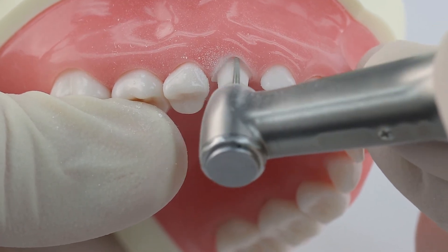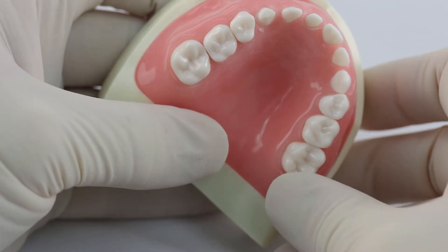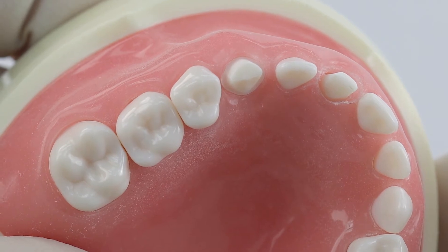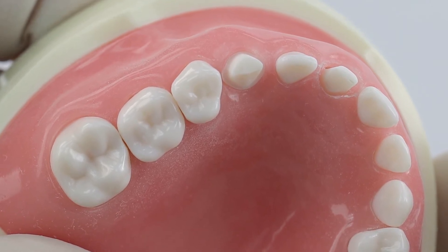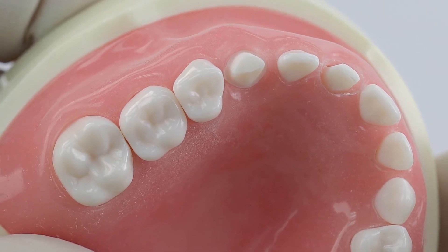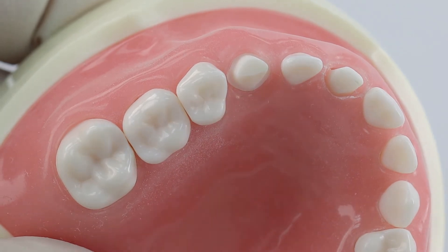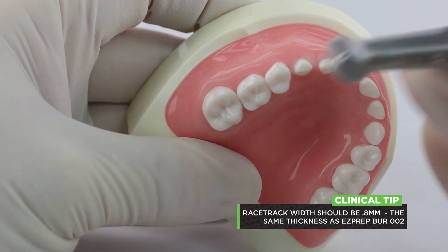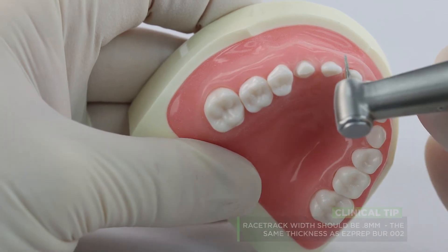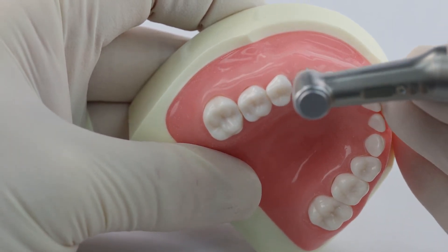That is our completed racetrack of our cuspid preparation. You can see that's a nice, good-looking racetrack — it's easily visible right away. Now the differences: the similarities between incisors and cuspids are that the cuspid is basically an incisor prep with all the same steps. Difference number one: your racetrack on a cuspid needs to be the full thickness of the tip of that burr, which is 0.8 millimeters. On incisors you can back off a little bit, but on the cuspid — just like a molar — you need to go the entire thickness of the burr.